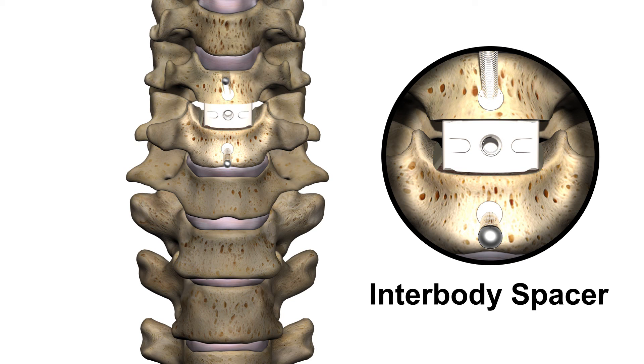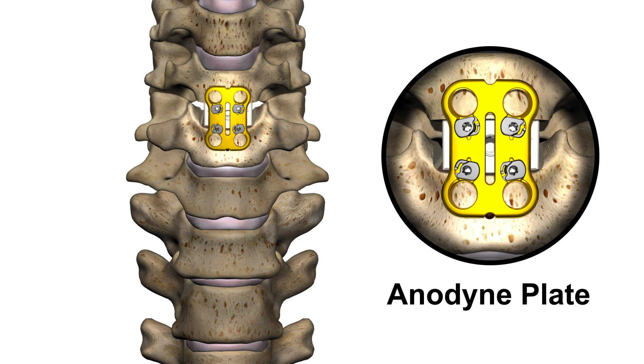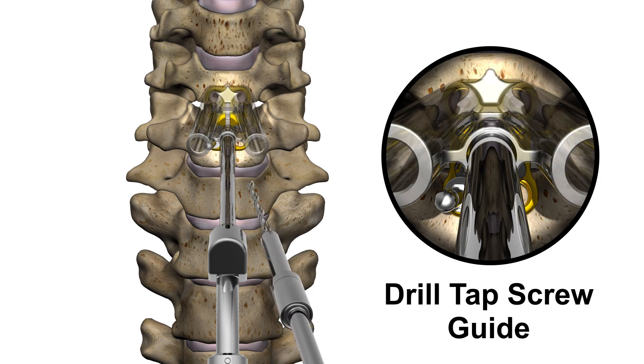Next, the anterior column of the spine is prepared for stabilization with a cervical plate. The surgical site is measured using a caliper, the appropriate size plate is selected, and a series of surgical instruments including guides, awls, and drills are used to prepare the vertebral bodies.